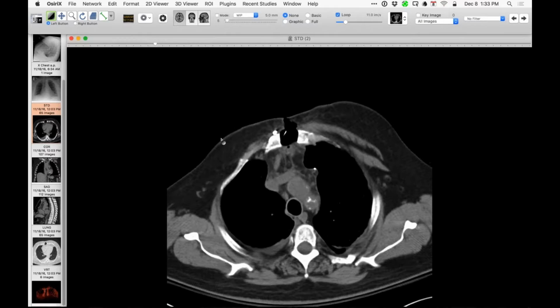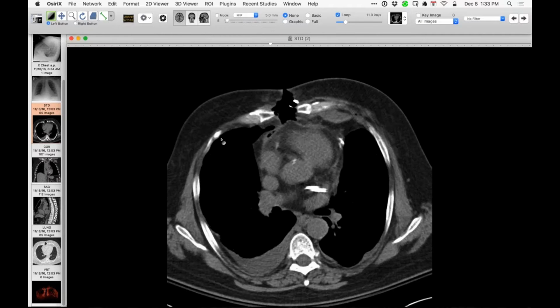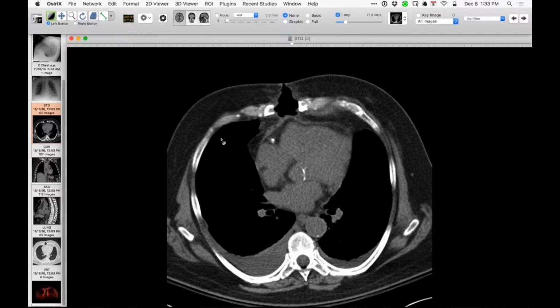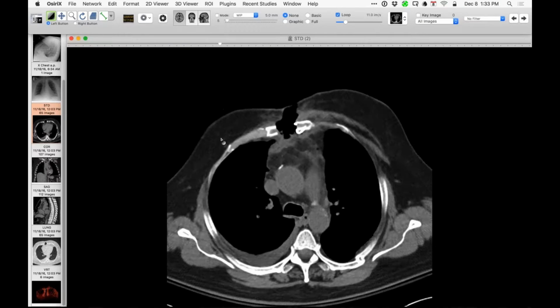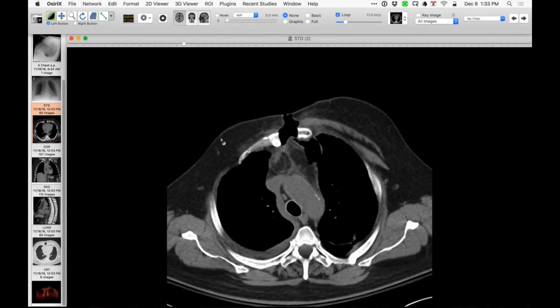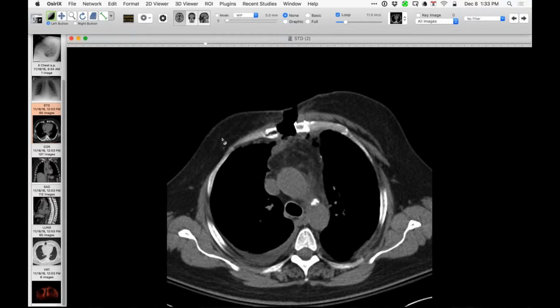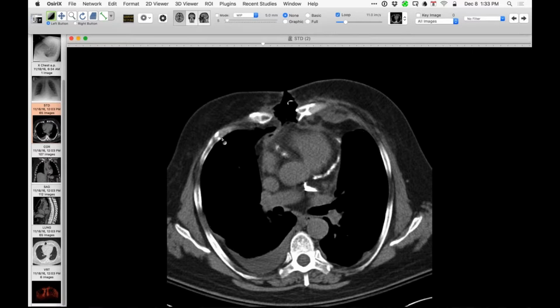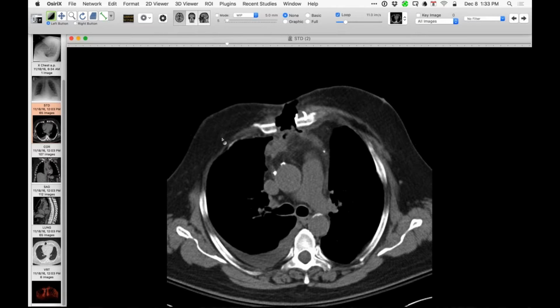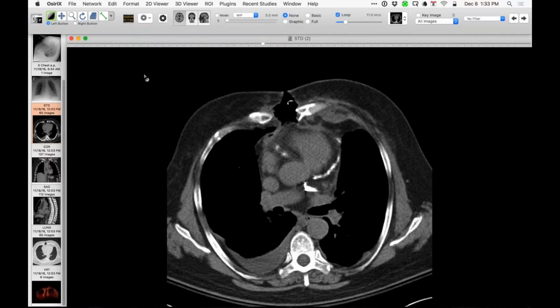Wow. He had surgery at another hospital, was transferred here to fix that, and I'm not entirely certain what caused that result. The surgery was just a couple of days before, you said? Yeah, I think 5 or 6 days before the imaging. That's definitely the earliest I've seen, because I usually think it's 2 to 4 weeks. That's kind of what I use, I don't know if that's what was written, but that's when I think about it happening, and even later, weeks, months later. Sometimes, yeah. That's early. This is way early.